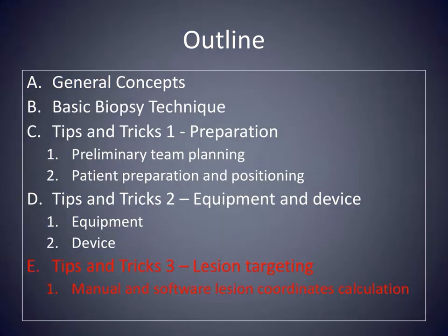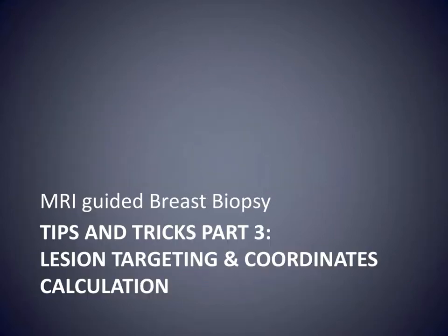This is the last section in this video on lesion targeting. We will go over lesion targeting using both the software that comes with the manufacturer for MRI guided biopsy, as well as manual coordinate calculation to be used for when there are technical issues with the software. Lesion targeting and coordinates calculation.